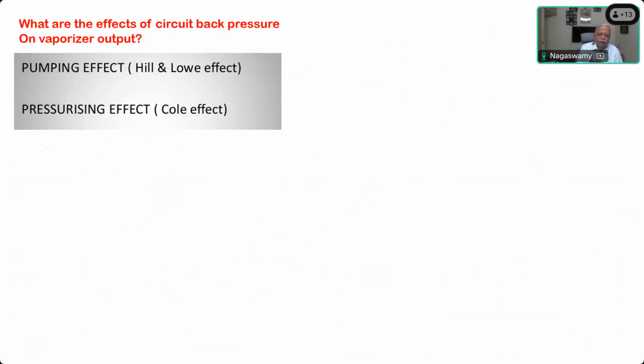When the pressure gets transmitted back towards the vaporizing outlet, the flow meter is still delivering the gases. It is not stopping to accommodate this back pressure. It's a continuous flow machine when we are using our regular workstation or whatever anesthesia machine you are using. Do you understand that or not? Yes, sir.